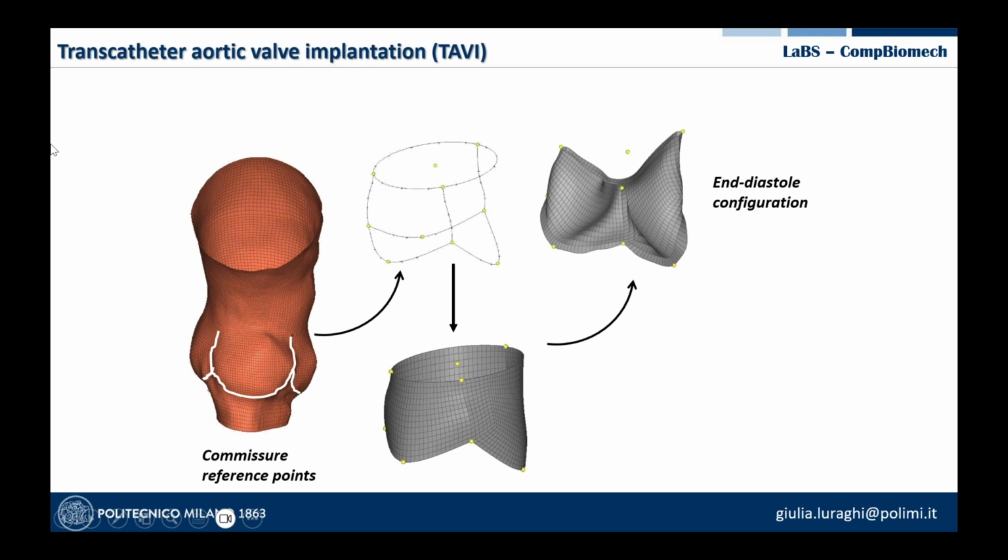We now have a different protocol for patients undergoing TAVI, and so now we can reconstruct from the CT images. In this case, we can reconstruct the leaflets from the images and also reconstruct the leaflets with this method and compare the configurations. But I performed this study 2 years ago, and at the time the CT resolution was not as good as now.